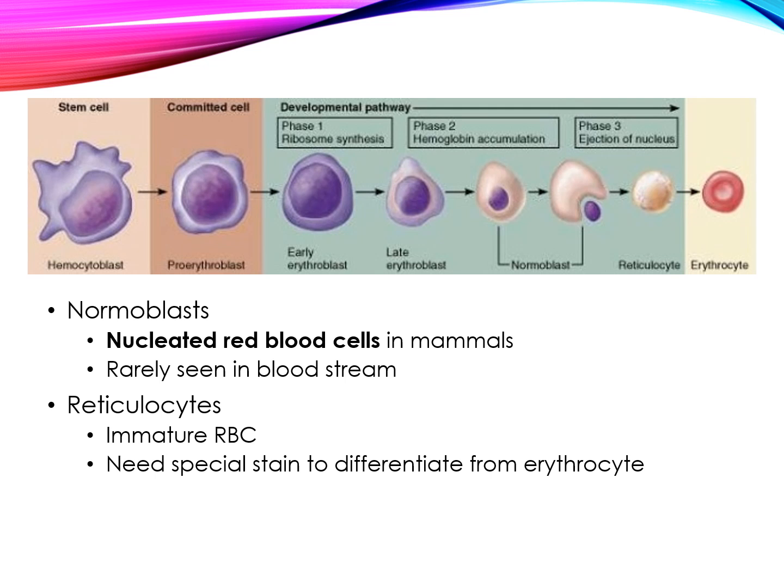And then the next stage is something called a normoblast, or what is otherwise known as a nucleated red blood cell. It is normal to see 2 to 3 in a blood sample, as they are just part of normal erythrocyte production. However, if you see a large amount of these, it may signal, like we discussed in the slide before, that there was an influx of red blood cells or need for red blood cells, and immature cells were released.